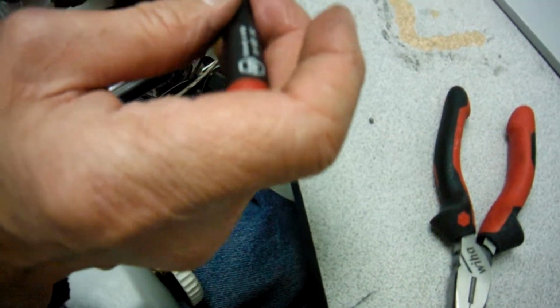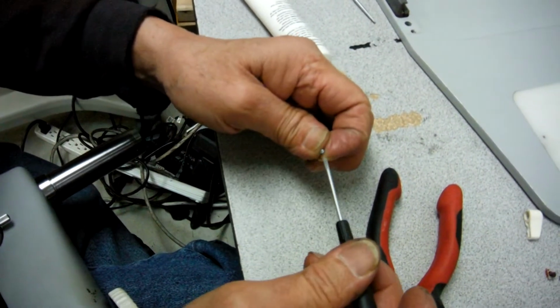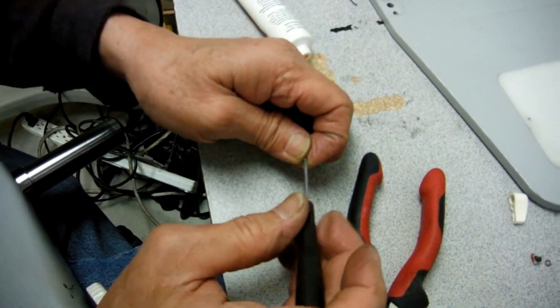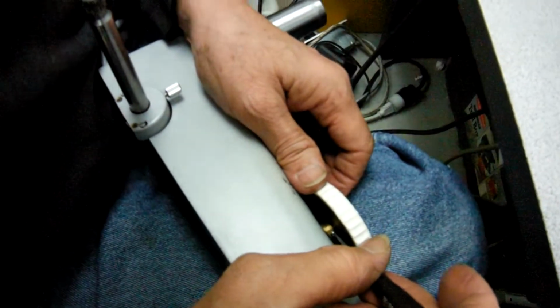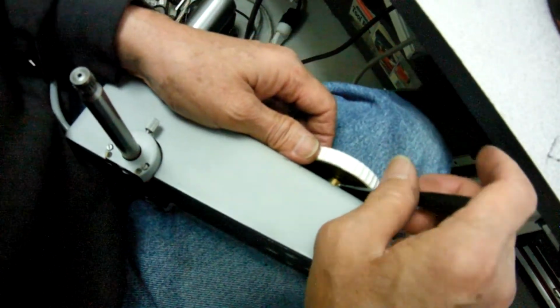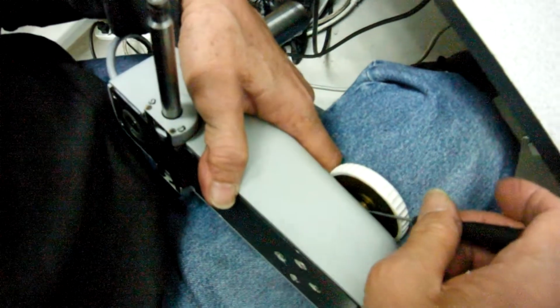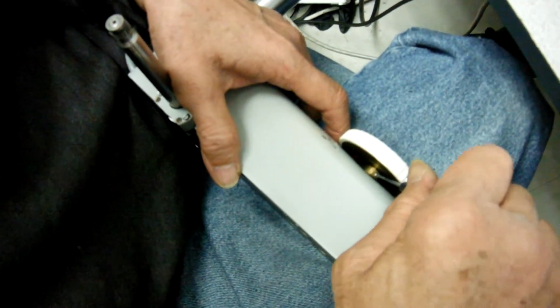In order to avoid that, you put a little grease on it, put it on the thing right here to hold it in place. Like that. And then you can slowly, but still carefully, put it in there like this. Make sure you go in there, or you can leave it this way so if it falls, it falls out on the other side.